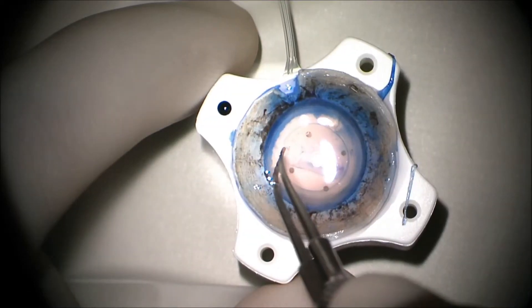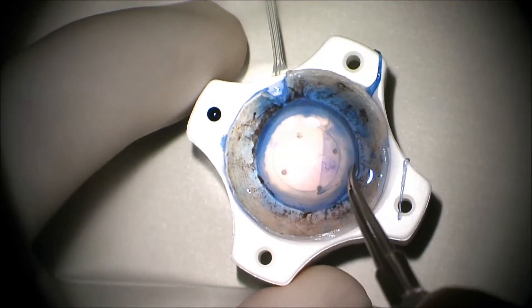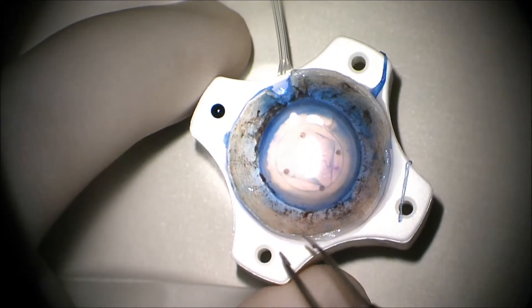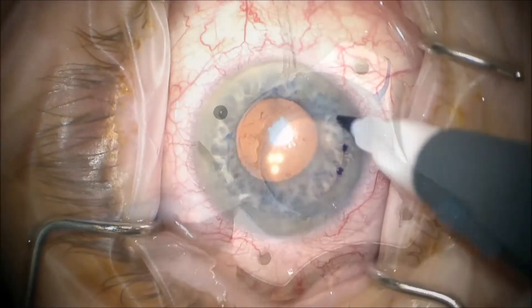So here we're basically removing the last segment that's been attached to the stroma, and then placing it back down, and then you notice that it starts to assume the correct folding conformation.